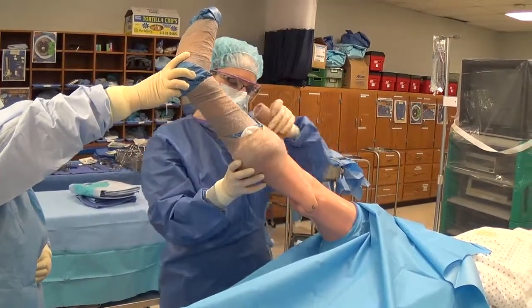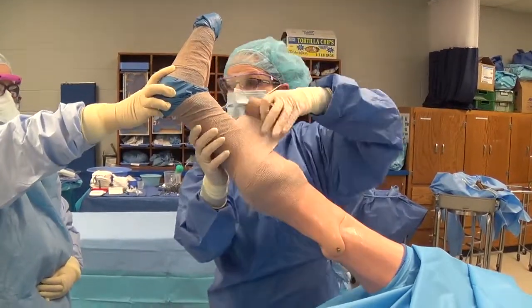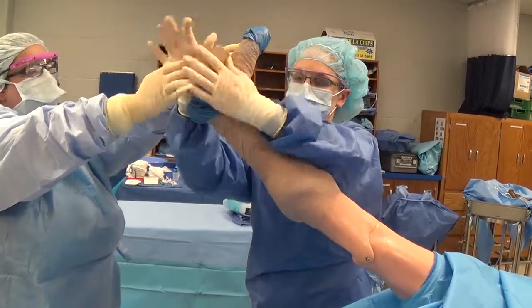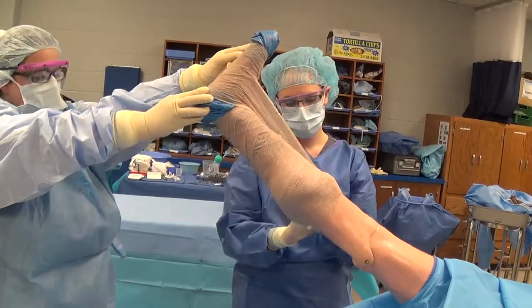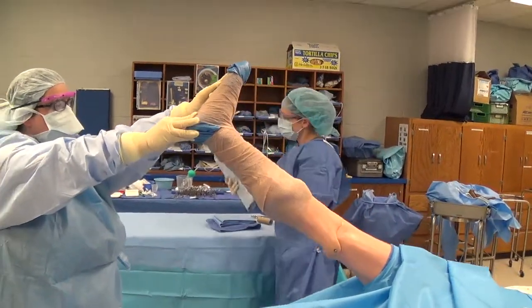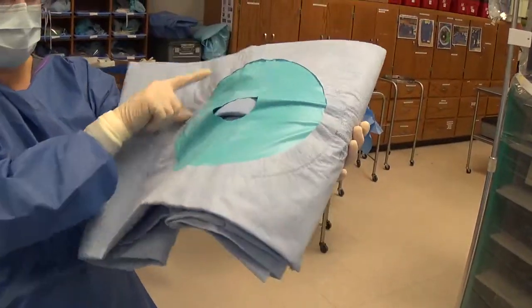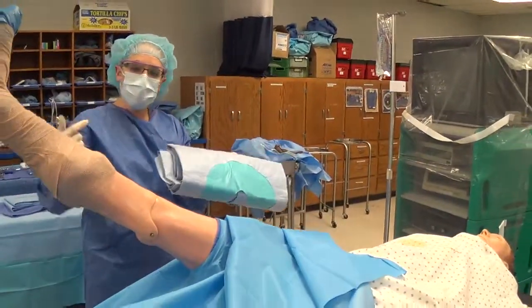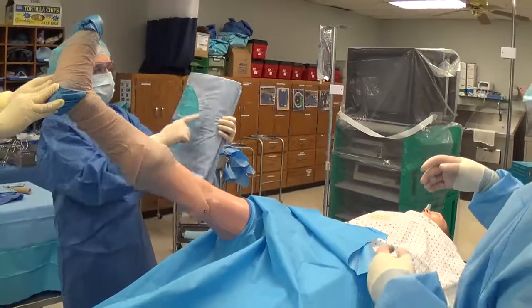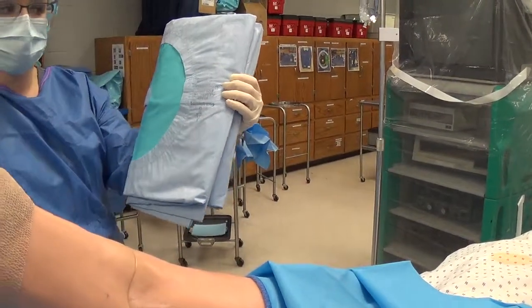We'll assume for this case that we're doing a procedure on the knee, so I want to make sure that I leave the knee exposed and just cover the rest of that stockinette with the co-band. The next sheet we're going to put on is called a lower extremity sheet. You can see it has a stretchy circular fenestration, which is different from our laparotomy sheet which just has a cut out. On this one the extremity is going to go through the sheet, so we need to open it above the extremity — not underneath like we did with the impervious split sheet. Sometimes you'll see a picture of a person and you want to make sure the head is towards the head, or it may say longer end and you want the longer end always towards the foot of the bed.